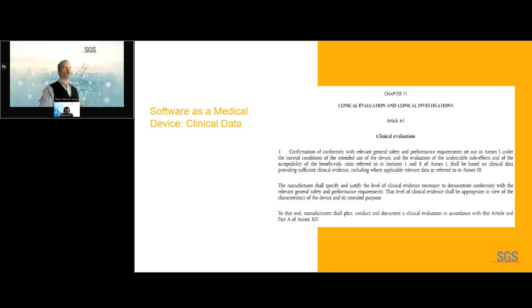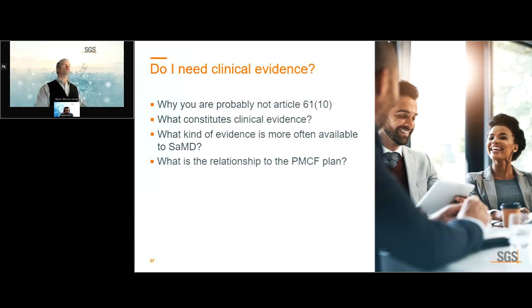One third of the MDR is dedicated to clinical or post-market surveillance in some fashion. And of all the MDCGs added and mashed together, there's somewhere between 500 and 700 pages of clinical evaluation guidance. So it is very important under the MDR. Do you need clinical evidence?